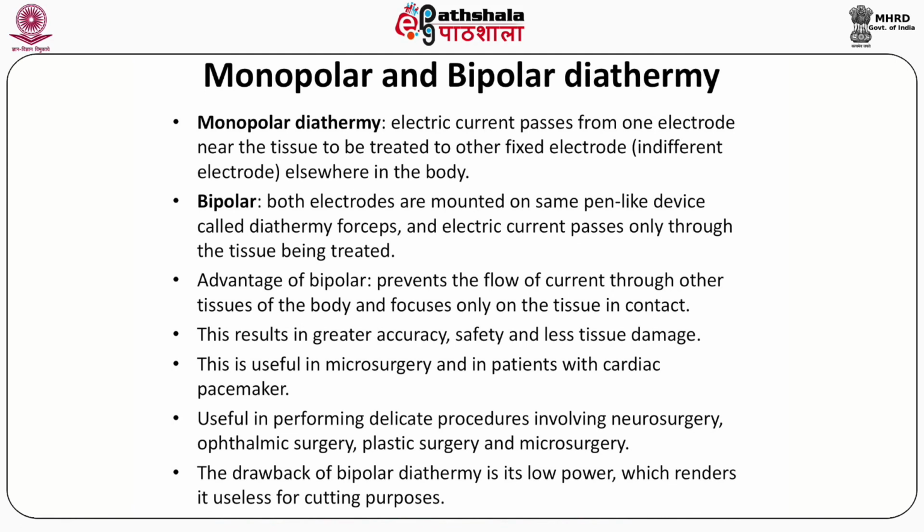But for any other purpose, like to establish hemostasis or to stop the bleeding, bipolar diathermy is used, as the accuracy and safety are better in bipolar diathermy, and the tissue damage is less in bipolar diathermy as compared to monopolar diathermy.